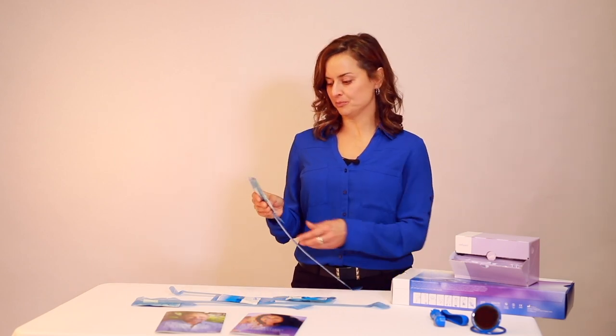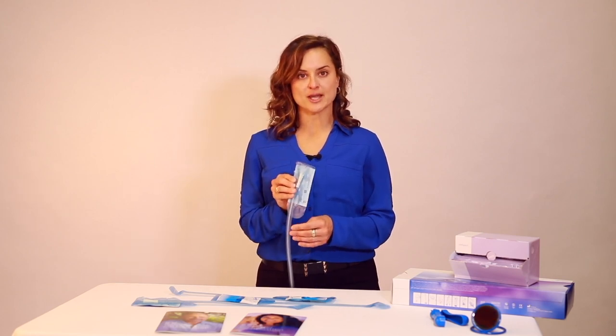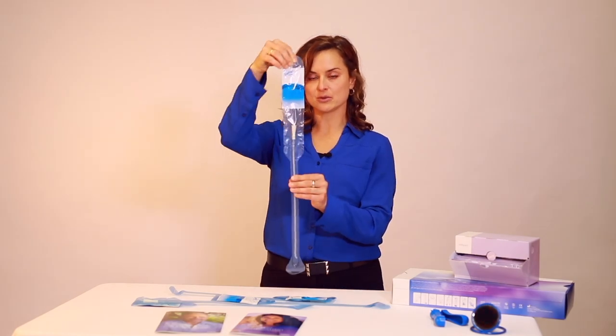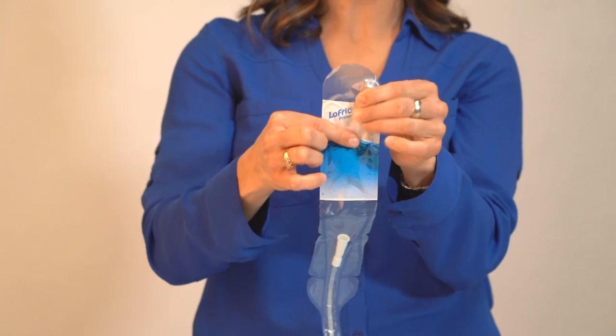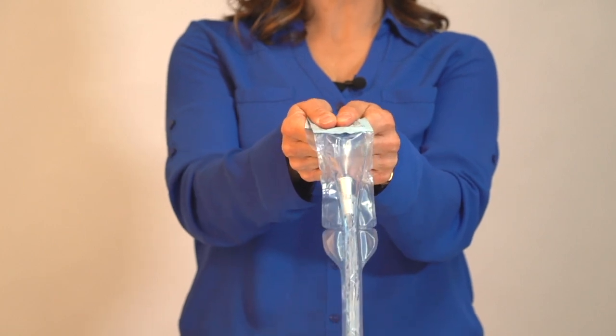Now I'm going to demonstrate two different ways to activate or lubricate Lofric Primo and how to open the packaging. The first technique is the peel-down technique. The first thing you'll do is un-glue or separate the water sachet so that the water sachet is on top of the catheter, and then move the water to the bottom half of the packet. Fold the packet over and press down quickly with your two thumbs.